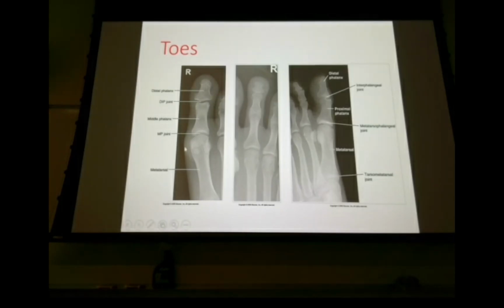So what we have here, it almost looks like that's pretty smooth, but it could be a sesamoid bone fracture here, and that would be what you refer to as turf toe. So where you run into things like that would be in patients who have high impact, continuous activity, runners, football players, ballerinas, things like that. They'll break those little sesamoid bones, and they can be very, very painful.